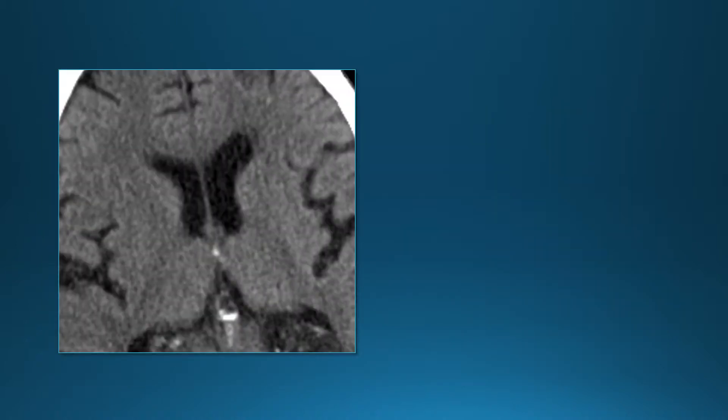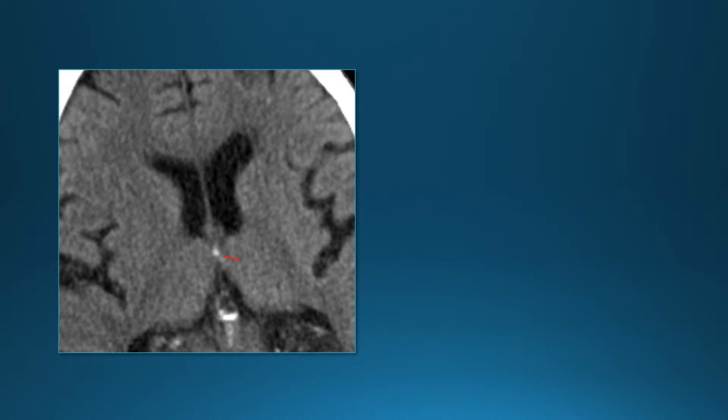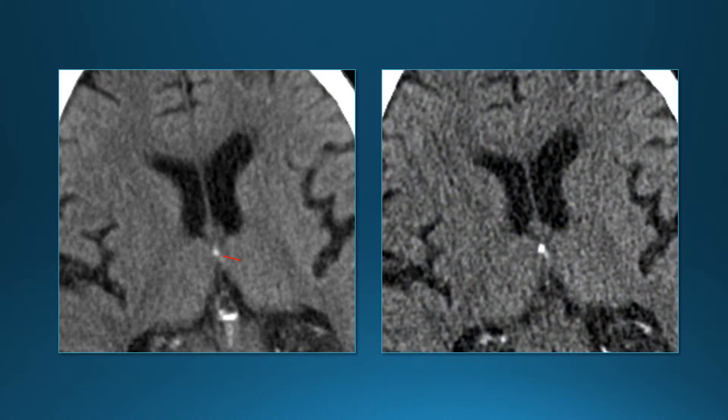Sometimes you can get confused — a high-density lesion in the anterior third ventricle near the foramen of Monro raises the question of colloid cyst, but you can also have calcified choroid plexus in this location. Thin sections make it easier to tell this is focal calcification in the choroid plexus in the roof of the third ventricle, and it can sometimes simulate a small colloid cyst.